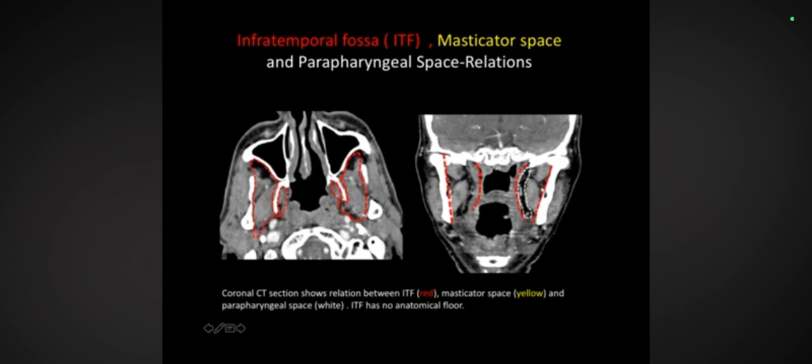Now if I exclude the parapharyngeal space but include the mandible and the masseter, then it becomes the masticator space. So the masticator space has the masseter, mandible, medial pterygoid and lateral pterygoid. The only extra thing there are all M's and one lateral pterygoid in it. But in the infratemporal fossa, you are excluding the masseter and the mandible, but you are including the parapharyngeal space and the pharyngeal mucosal space also. So remember this. Everybody's clear?